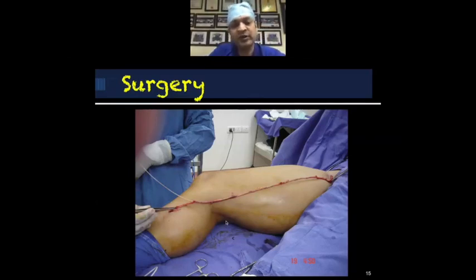So open surgery is a good method wherever the laser is not available. I'll say that surgery is not out, especially in our country where laser cannot be afforded by everybody. Especially in the government hospital, and I feel surgery will still have a place in our armamentarium.